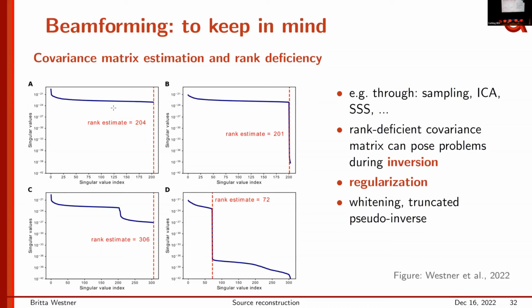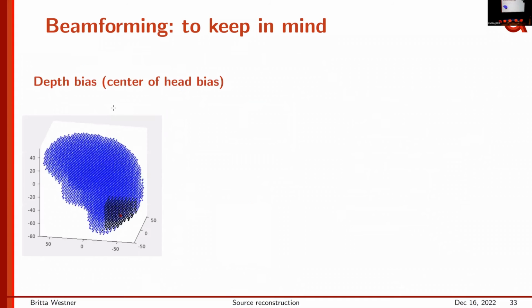So something like this, what we have in our data, in fact, is a bit more challenging to work with than this. In practice, if you want to do beamforming, think about it from the beginning of your experiment and be very careful about what you throw out of your data, and think if it's really necessary. Don't just max filter your data because you can. Do it if you really have to. Okay.